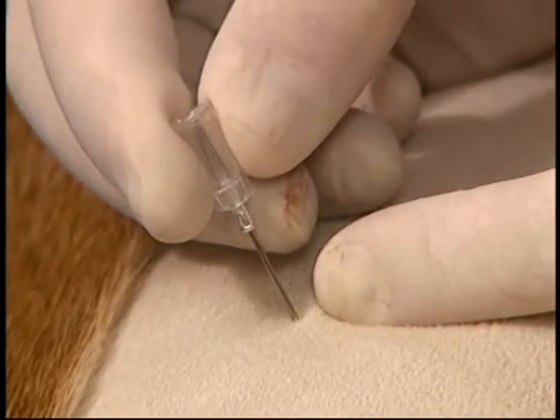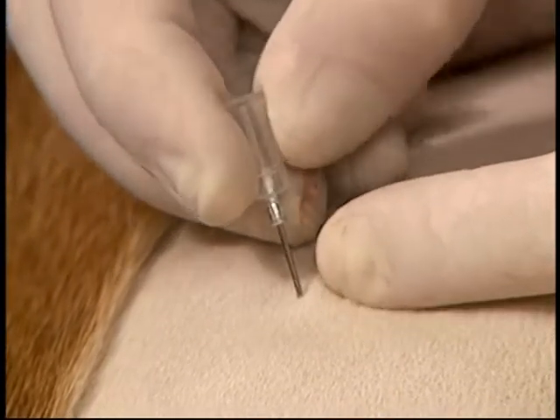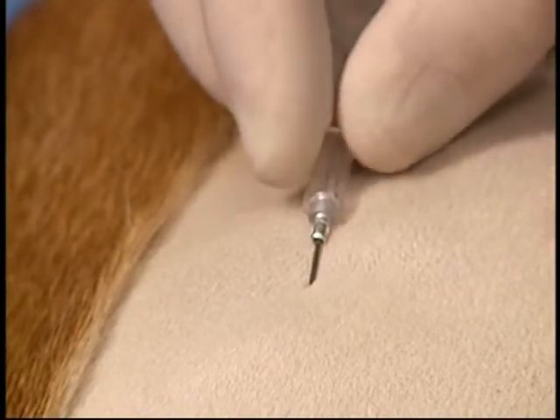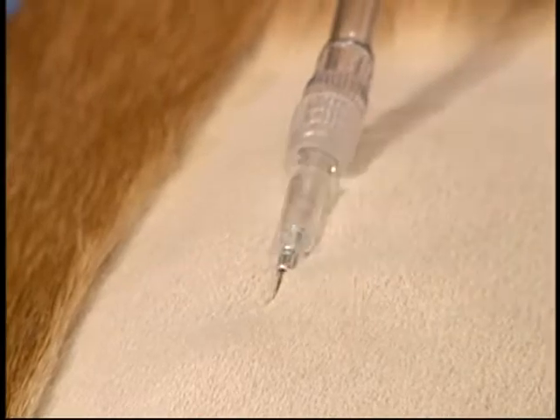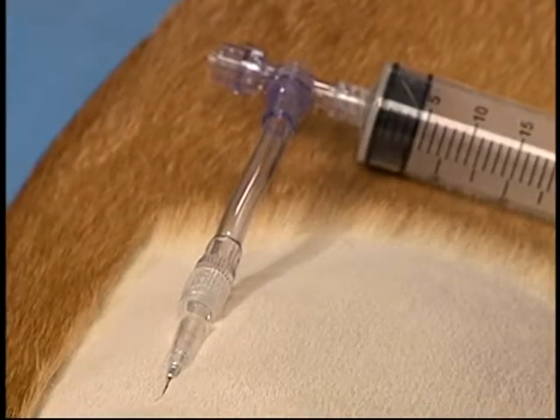Once the needle has penetrated into the pleural space it is advanced another two to three millimeters, and then tilted laterally to ensure that the bevel is outwards, so the needle will not insert into the lung as fluid and air is aspirated.